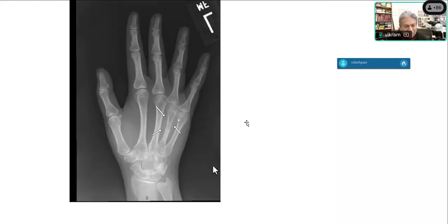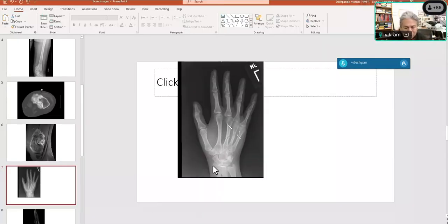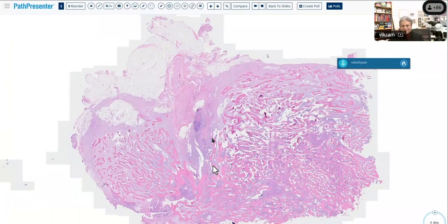So with that, we'll go back to, he already made a diagnosis, right? This is really a great example of the fact that the surgeon already knows what's going on, right?